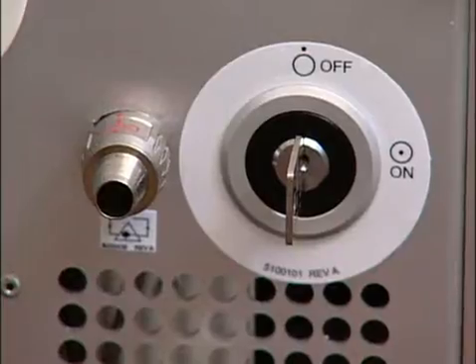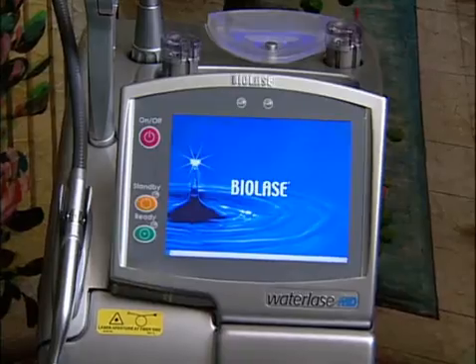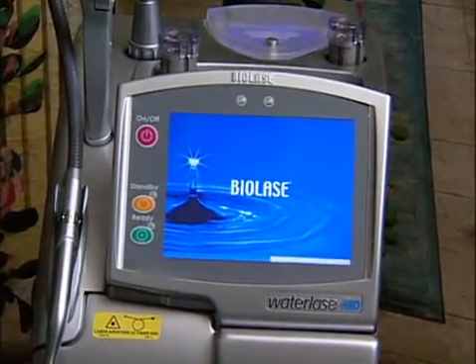I'm sure that the serviceman and or the salesperson that you deal with will go over a lot of these details with you. It's just kind of fun to be able to see it on DVD and review them for your new staff that come along. So we'll just start with basically turning on the unit. And remember, it's a laptop computer and it has to boot up.